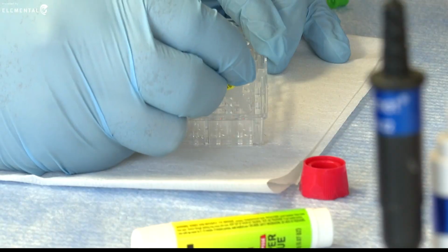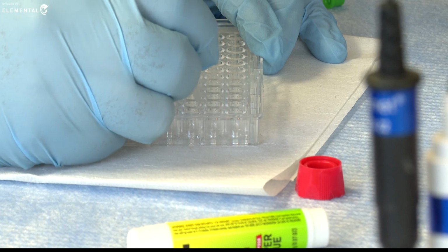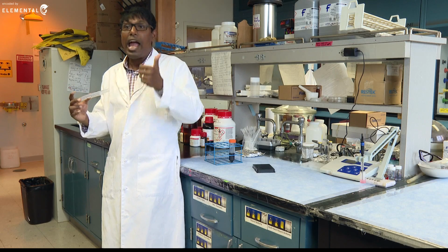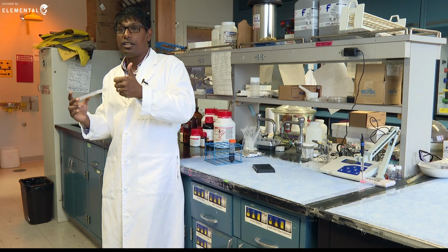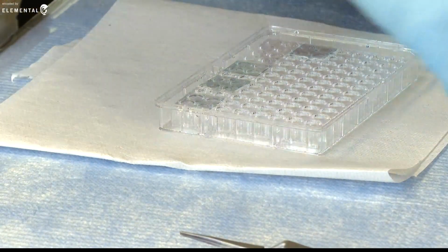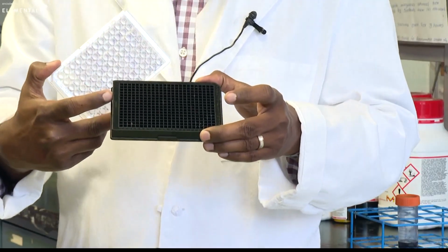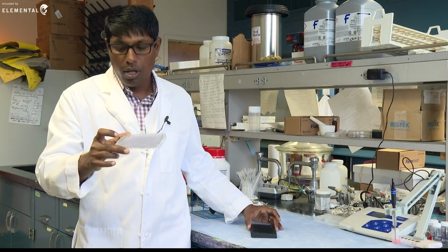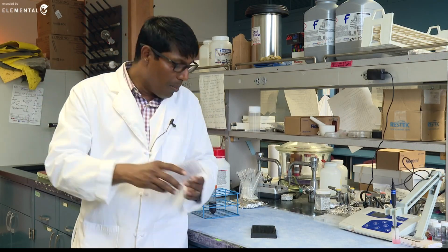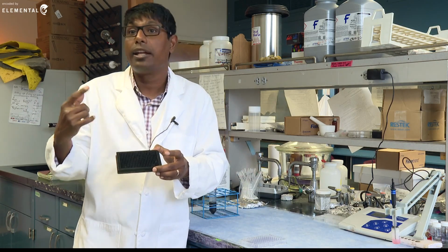So this team took it up a notch with a 96-well panel, testing nearly 100 samples at a time. We designed our sensor in such a way that it is very sensitive and it is very specific to COVID-19. But even that isn't enough to test mass populations quickly, according to Dr. Sardar. So researchers here bumped it up again from 96 to 384. Because these wells are a little bit bigger, it takes a little longer time to scan an entire area. But because this area is small, the sensor, that's why we can scan it much faster.